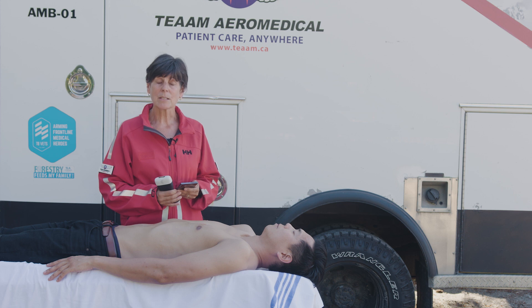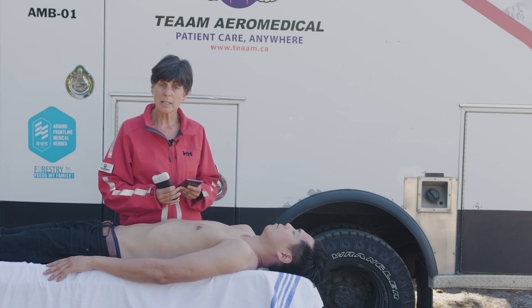The FATE exam gives us a really good look at how the heart is functioning, and we can also rule out pericardial and pleural fluid.